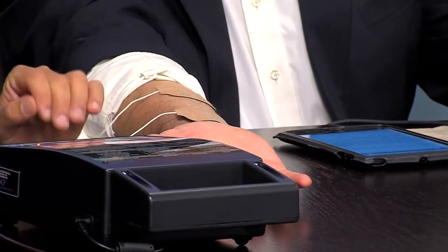Julie was talking about the wound vac. When she originally started, we put the wound vac on. It's a seal. It's got a drain. It goes to a pack that suctions the bad things from the wound. But you've got to carry it around. It's on your shoulder. You've got to run the hose through your pants, and you have to sling this over, and you have to walk with your crutches. Very cumbersome.